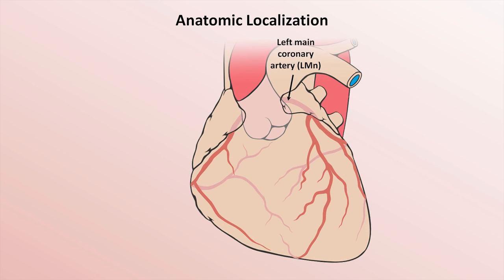In order to localize STEMIs and Q wave MIs to a specific region of the heart, or to a likely culprit vessel, we'll need to review some cardiac anatomy as well as revisit the earlier topic of EKG lead groupings. From a clinical perspective, the ventricular myocardium can be subdivided into different regions, often called walls. The subdivisions are not exact, and not everyone uses the same list.